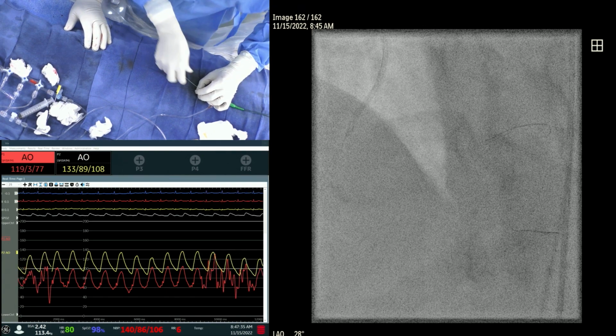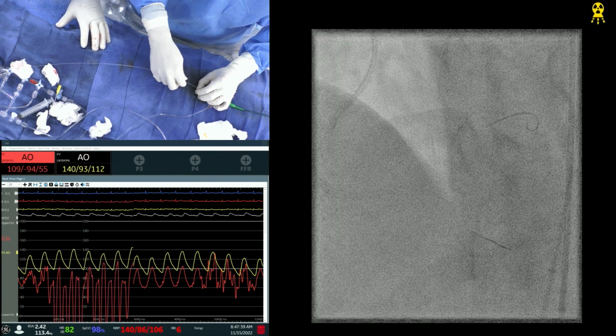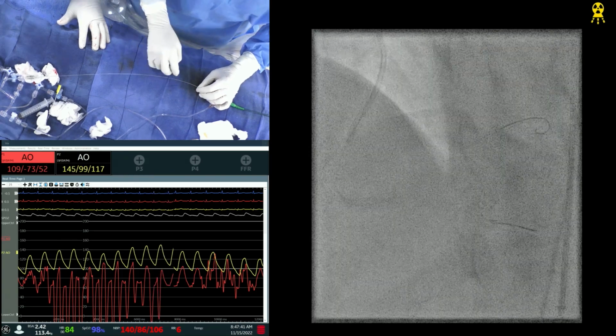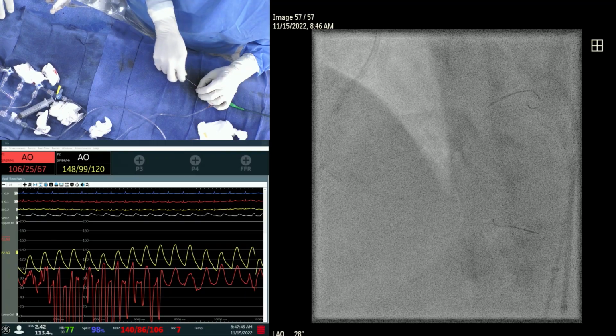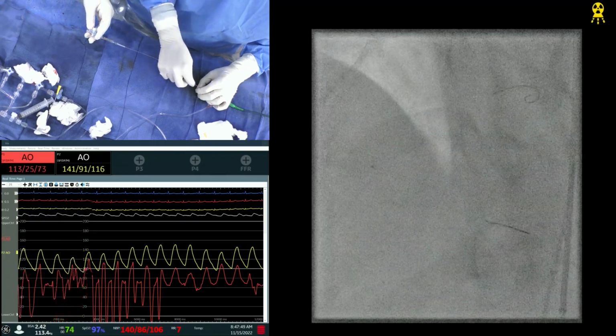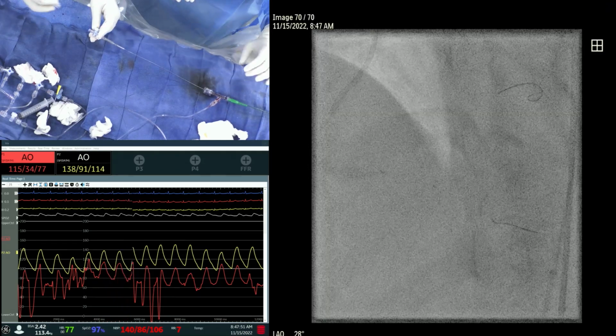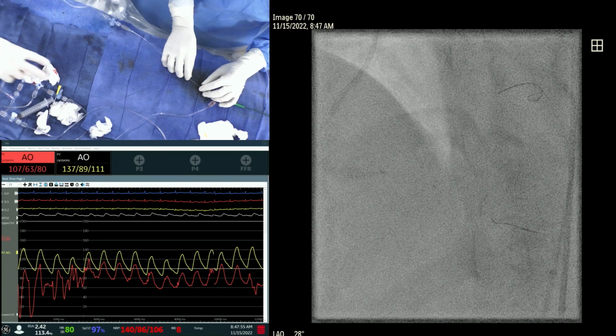So we have to dilate the distal, and the concept of provisional is okay too, because it all depends on how we balloon. Actually, we never ballooned the AV continuation either, so we're going to balloon the AV continuation now. Okay, hold it. Then we decide the stenting strategy.